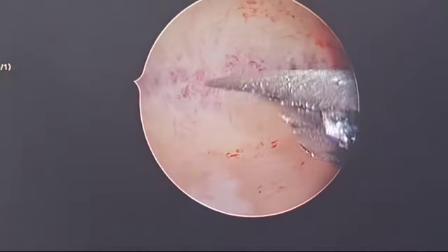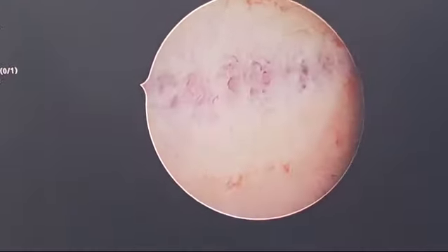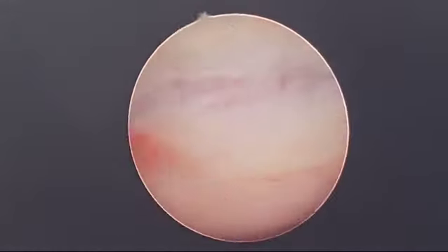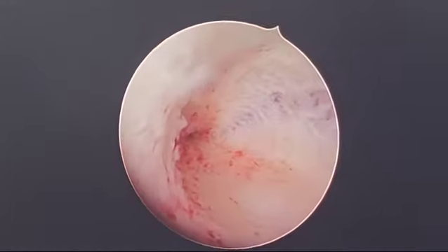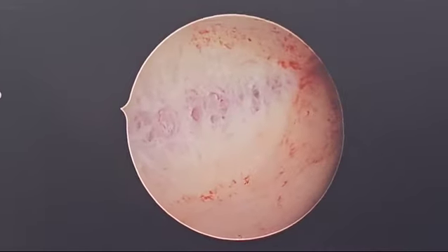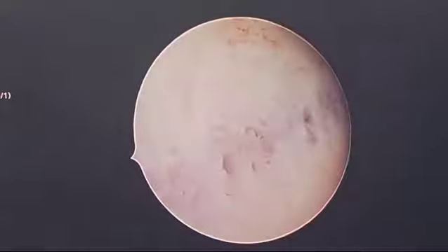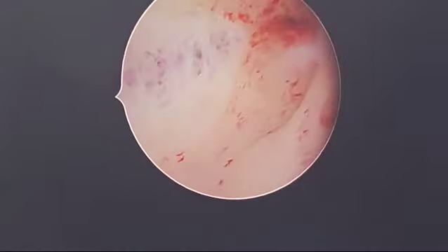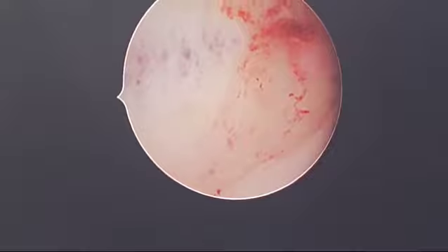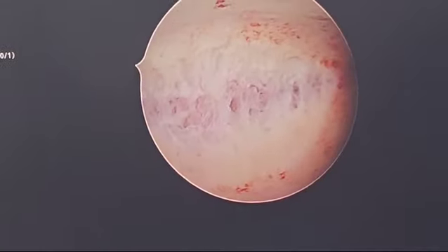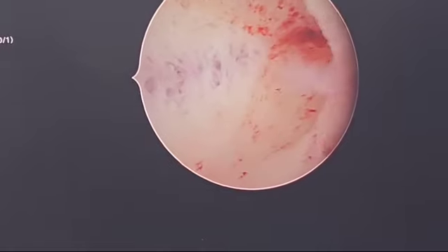We can clearly see the myometrium here. The normal cavity has been restored — we can see the arcuation is now released. We could not cut more because of the risk of injury to the myometrium, which may lead to rupture or muscle compromise during pregnancy.